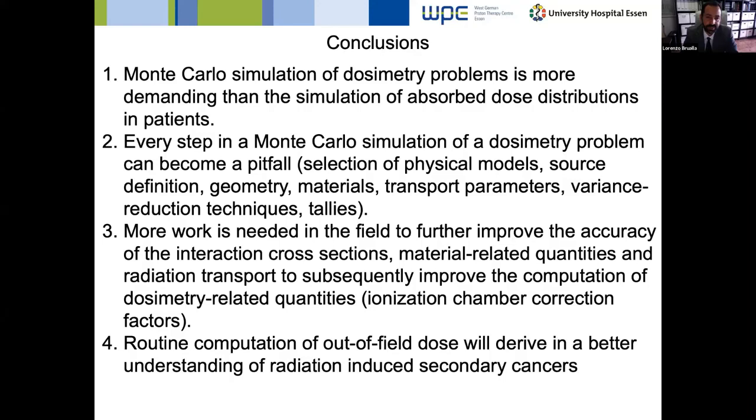I am a user and very closely related to the PENELOPE team, and of course I would like to tell you PENELOPE. PENELOPE has arguably the best multiple scattering models in the market for electron transport or for charged particle transport, also for the electromagnetic part of protons. The results that we are seeing with PenH are very encouraging. However, in the case of PENELOPE, PenH, only protons are simulated. So if you want to take into account neutrons, then it is out of the game. So I would definitely go for Geant4 with TOPAS, alternatively for FLUKA with FLAIR.